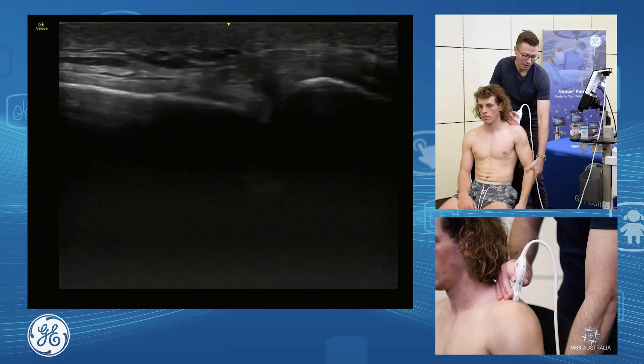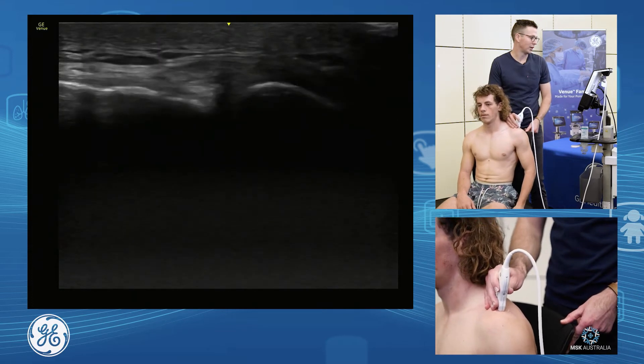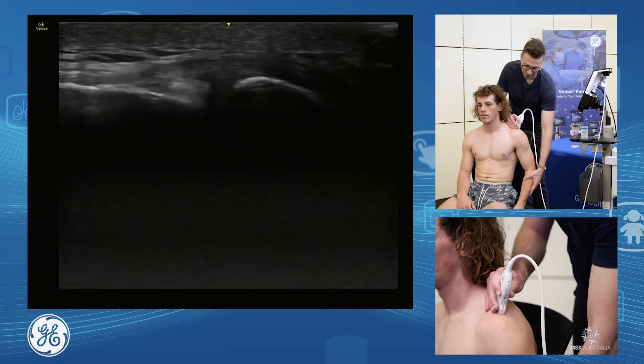We can also have a look in weight bearing — just put your hand on the chair there and push in through there, and relax. And again, push through that arm, lift your bottom up, and relax. So we have a nice stable AC joint.